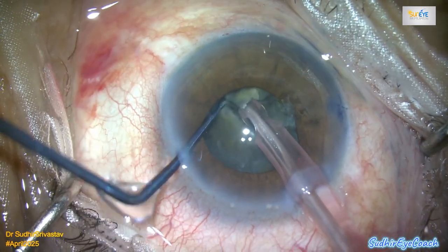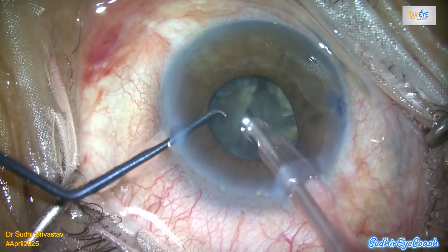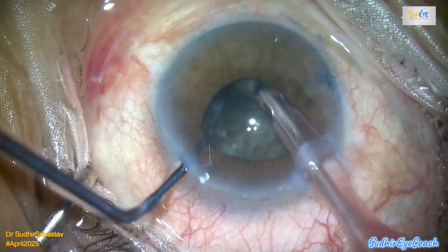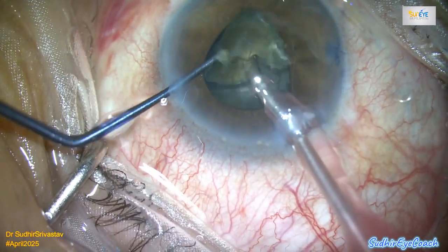Keep your focus on the pupil margins and the phaco tip at all times. Never perform any maneuvers blindly. Avoid going under the iris or doing anything out of view. If you follow these precautions, even a tough case like this can be completed successfully with a small pupil.